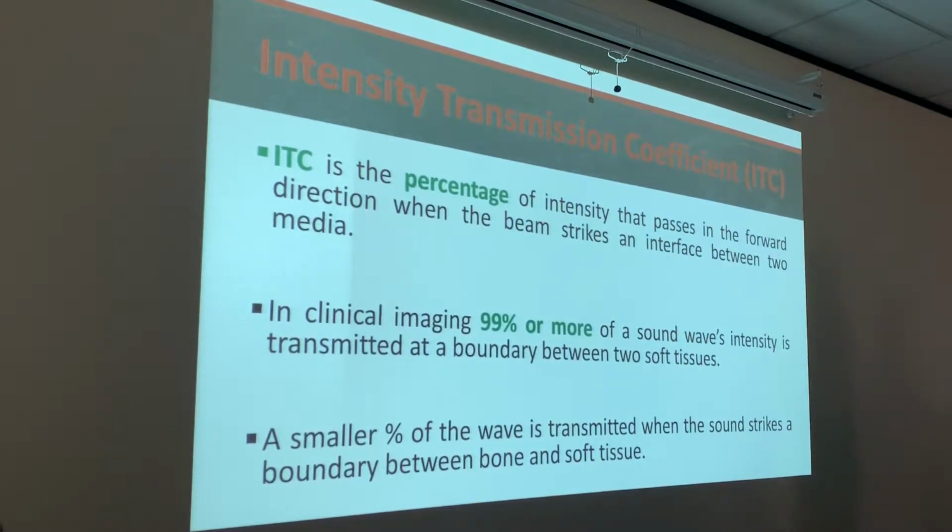Like in something that's fluid filled, the bladder, the gallbladder. Start paying attention, guys. When you're looking at your gallbladder, you'll see that posterior enhancement. It won't be as bright as when you look at the bladder. The bladder, you see it very well. You have a cyst, you see it very well.